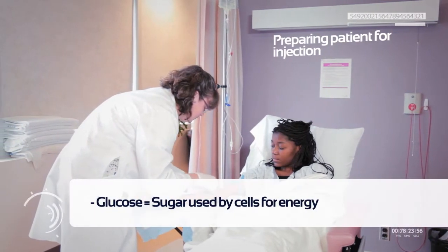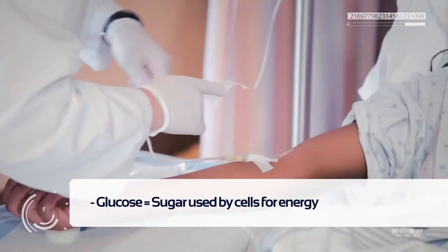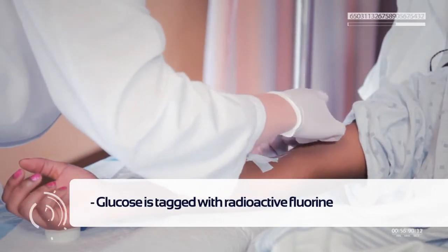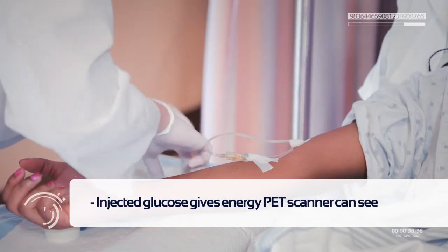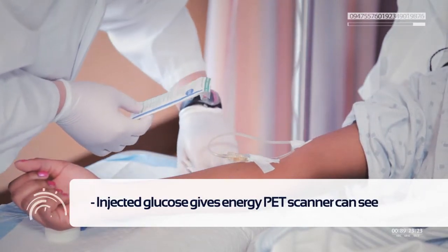Glucose is the sugar that is used by all cells of your body for energy and other processes. The glucose used in PET scans is tagged with radioactive fluorine. The patient's body treats it just like glucose, except this glucose now shines with energy from which a PET scanner can create an image.